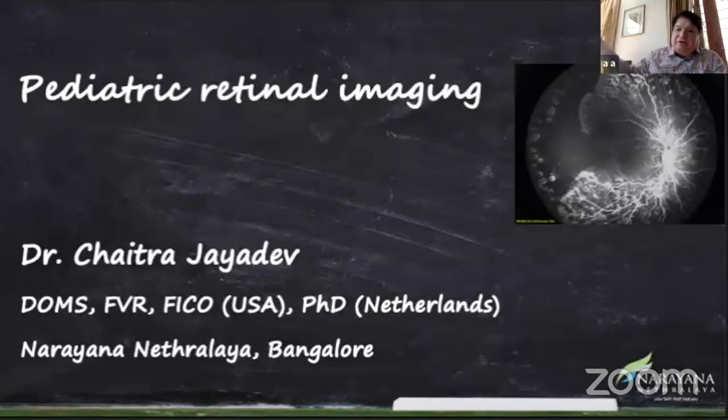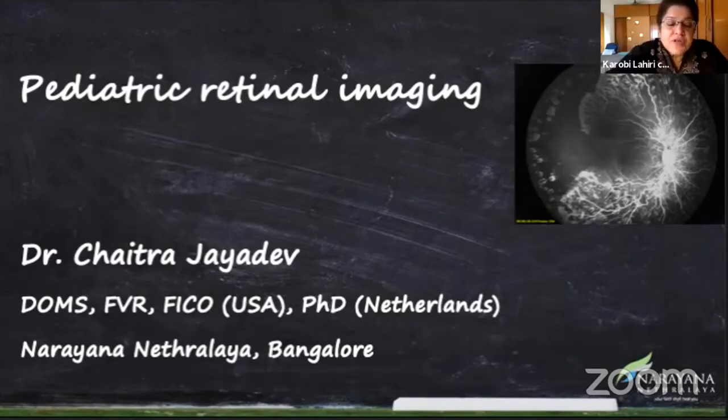See, in microperimetry, you are tracking that whole area of retina which you selected. It's like a perimetry where you keep testing all the spots. The patient keeps responding by pressing a button. If he sees it, he presses, and the value goes down or up. So probably that doesn't correlate with exact figures of 20/20 or 20/40, whatever. But it is helpful. I don't know whether they now give it with the OCT machine, but now you have to buy a separate microperimetry. Again, this machine can be used in pediatric patients?